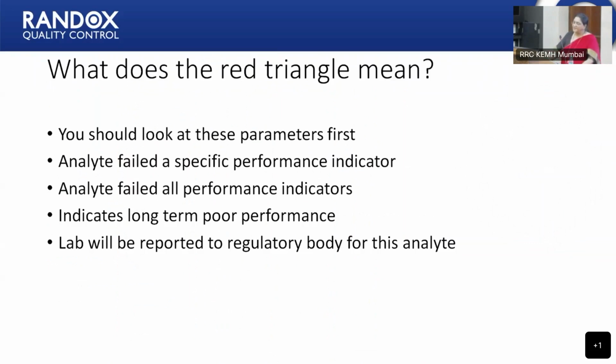It means that you should look at this parameter first. Whether the analyte has failed for a specific performance indicator, or all the performance indicators are beyond acceptable limit, or whether it is indicating that long-term poor performance is there.